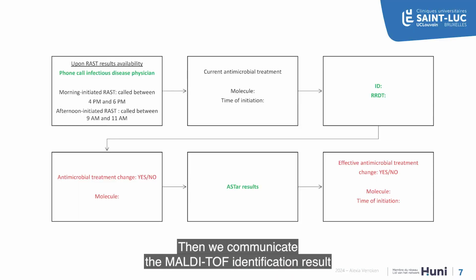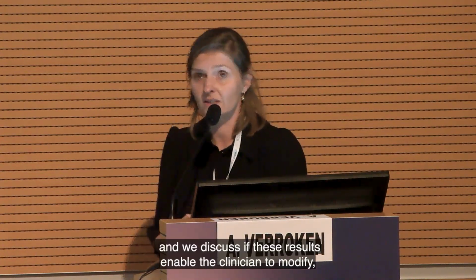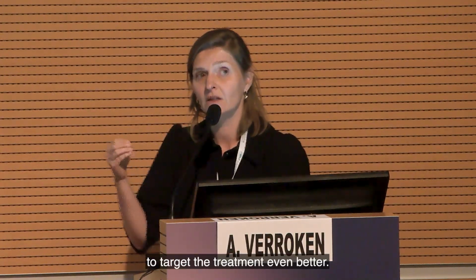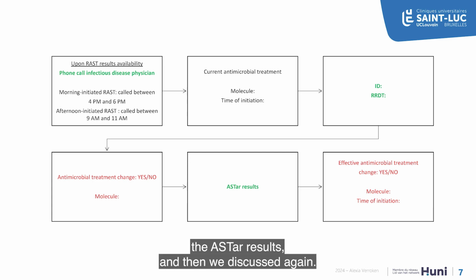Then we communicate the MALDI-TOF identification result and the result of the rapid resistance detection test. That's what's already done in our routine, and we discuss if these results enable the clinician to modify, to target even better the treatment. But in this study, we communicated during the same phone call the ASTar results, and then we discussed again.